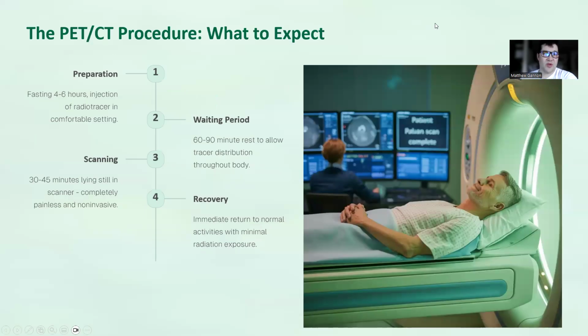So what happens when someone comes in here? It's a really long exam. They have to fast, and then they get an injection, and then they have to hang out there for the injection to allow the radioactive isotope to distribute to their body, and then kind of react to the cells in their body, and then they have the scan. Even in the scan they have to lie still as well for 30, 45 minutes, which is a lot more even compared to MRI. So it's a really difficult exam, and this is why my hat's off to nuclear medicine technicians, because it's a very intimate exam. You want people to feel comfortable. You want them to feel okay.